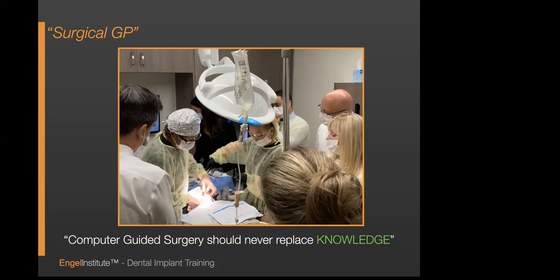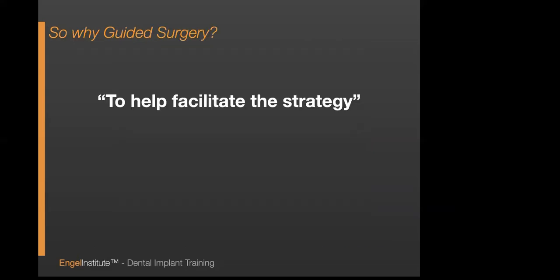Guided surgery should never, ever, ever replace knowledge. Guided surgery is to help facilitate the strategy, and I'm going to show you exactly what I mean. In a certain case where I might have narrow bone, I could do it freehand. But maybe the movement is limited. Maybe the prosthetic demands are such that the implant needs to be in exactly one position to pull off the prosthetics correctly. I'm going to show you what I mean with one that went south on me in a few minutes. So keep this in mind.